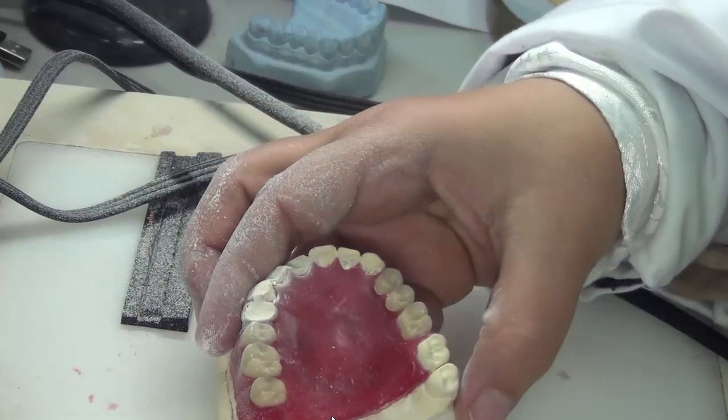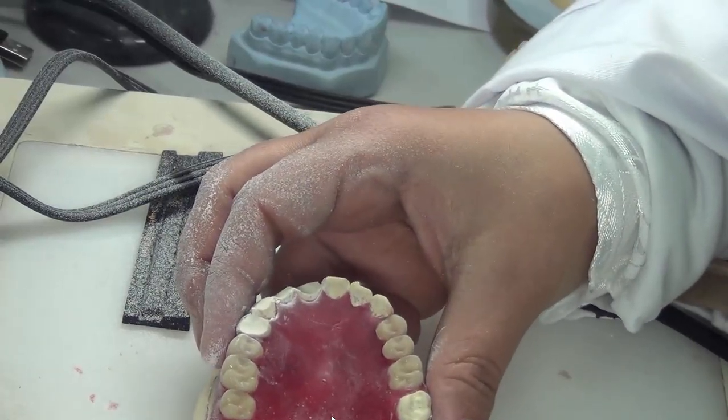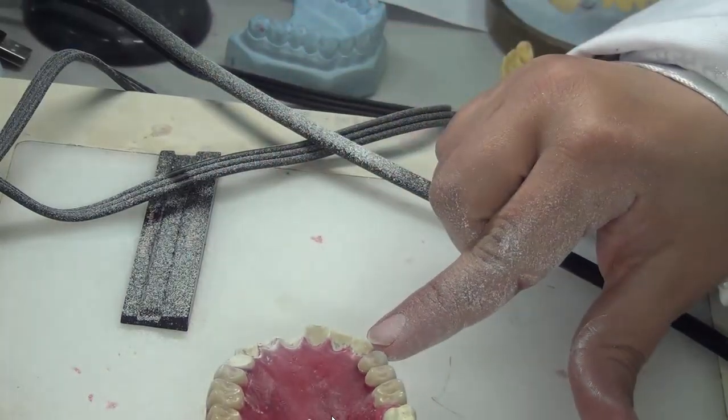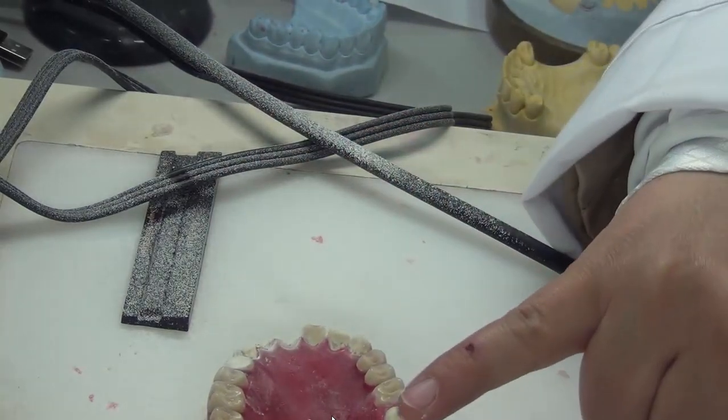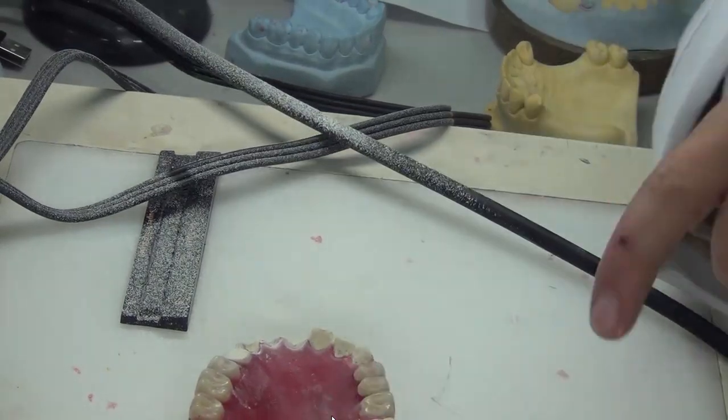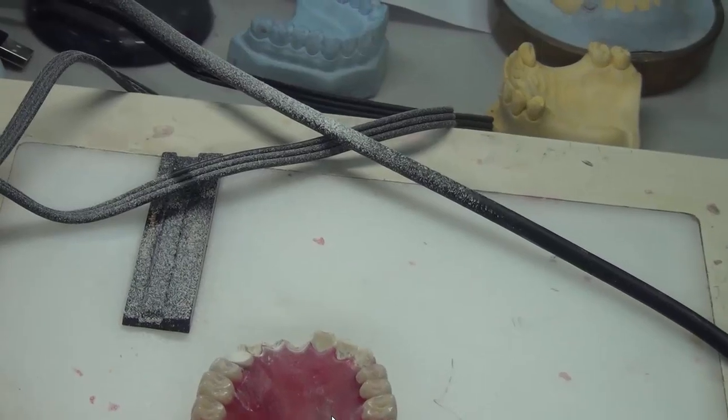So notice that I have not touched the wax lingually, okay? So I continue with all the natural teeth on the anterior area, and I also do the natural teeth posteriorly. I don't touch the clasp, I don't touch the wax lingually, and this is the step you could begin now.